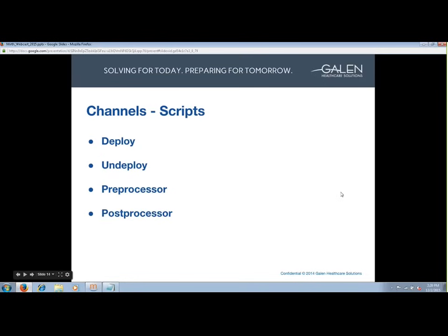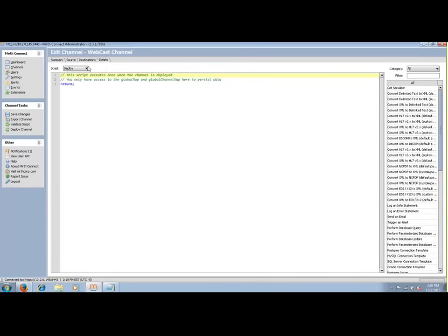Last up for the tabs are scripts. There are four types: deploy, undeploy, preprocessor, and post-processor. Deploy script executes at deployment and is used to set up channels, define global variables, or create shared connections as a channel goes live. Undeploy executes when channels are shut down and could be used to perform cleanup — for example, your deploy script creates a connection and your undeploy script closes that connection.